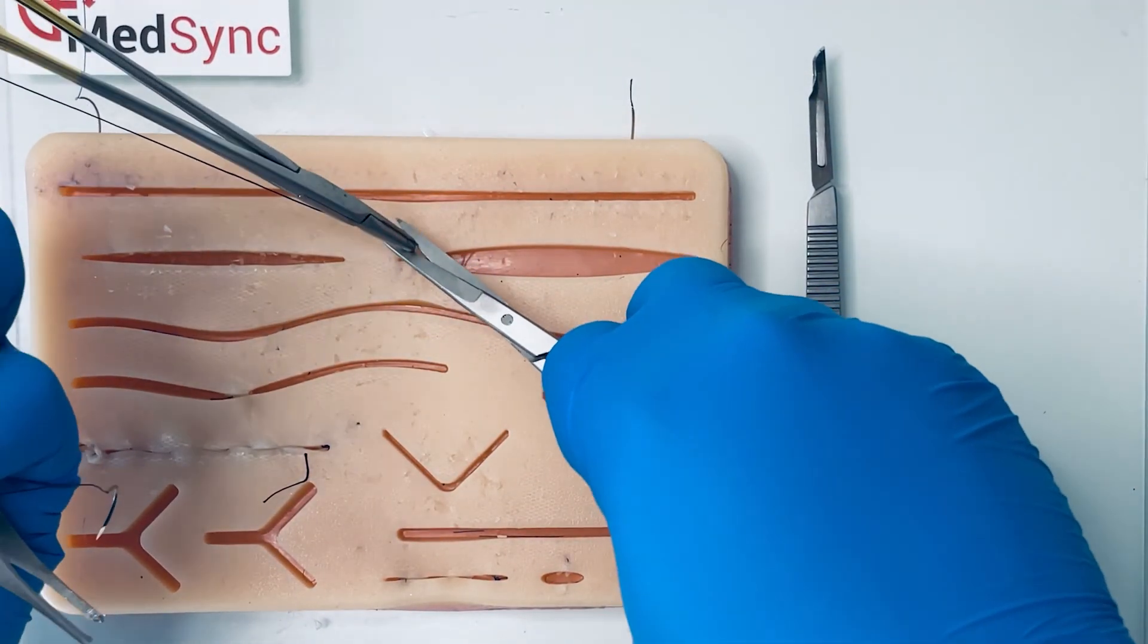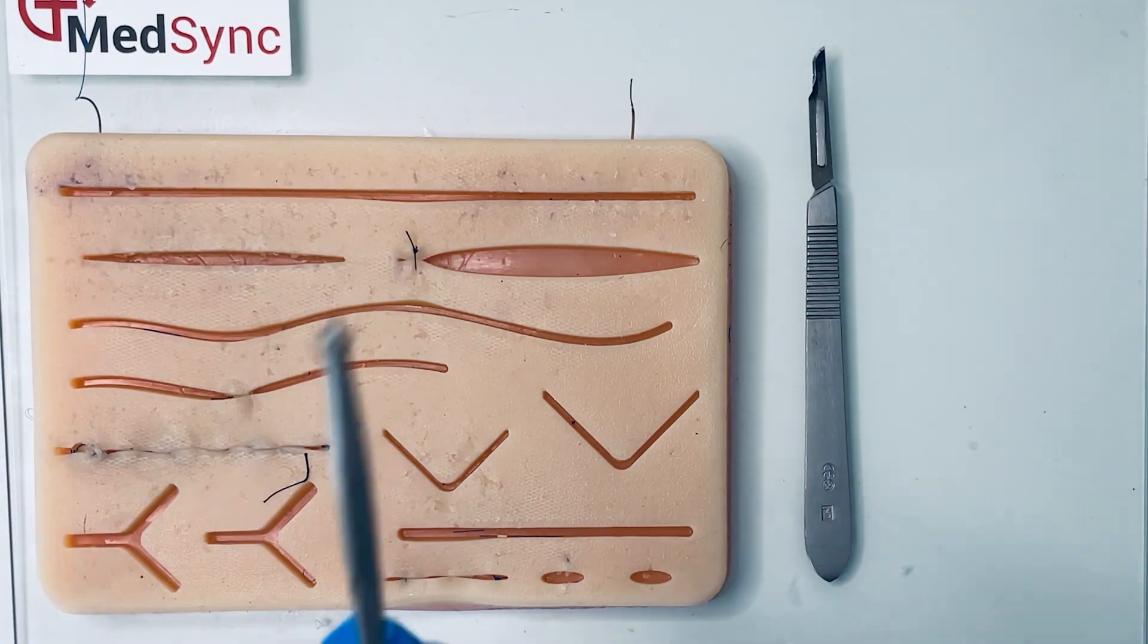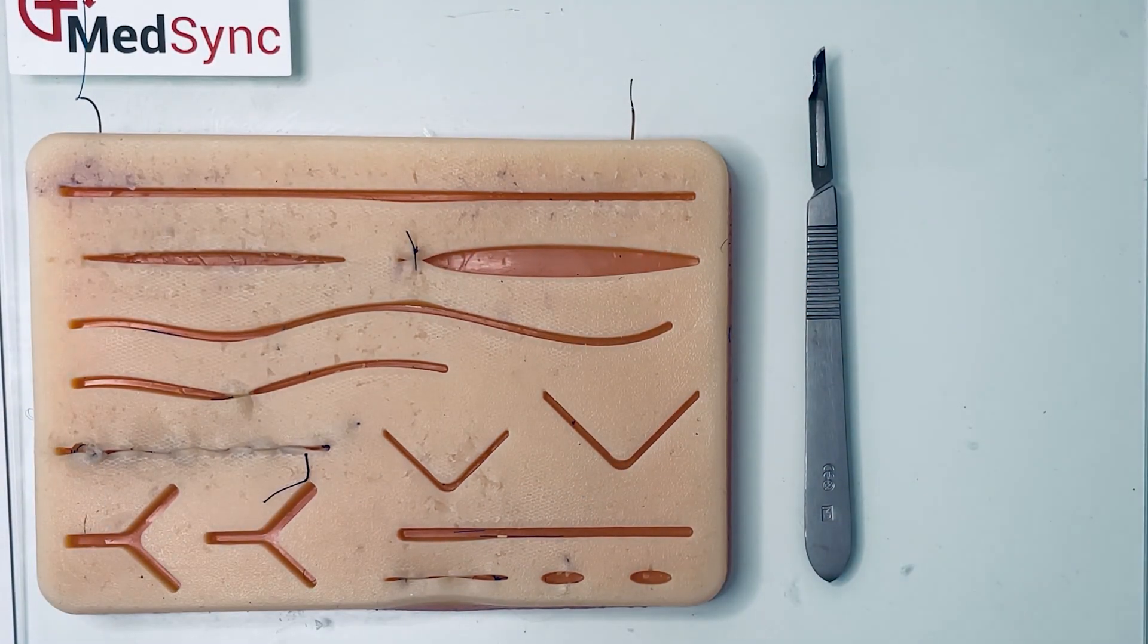The second is to start at the apices and work towards the middle. The final two techniques require some finesse.